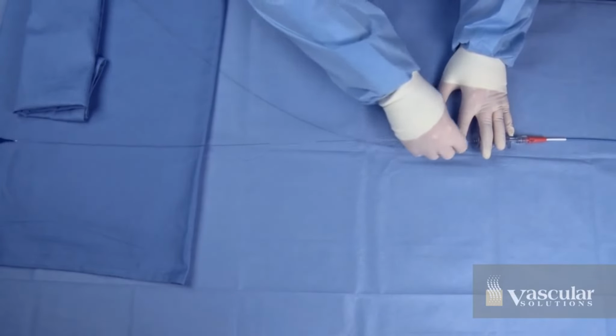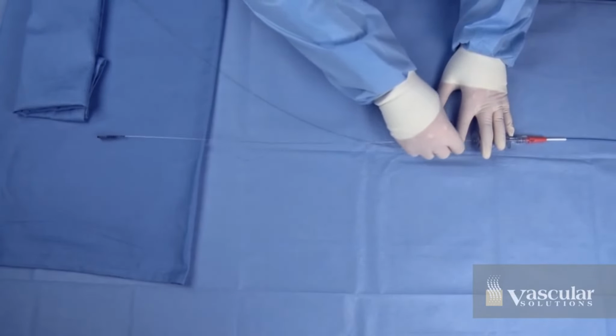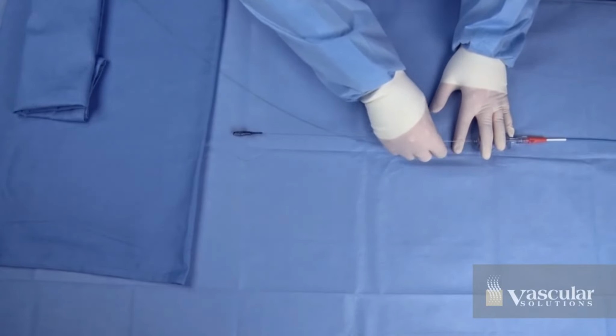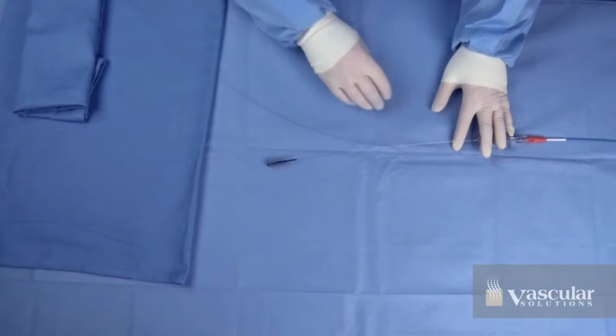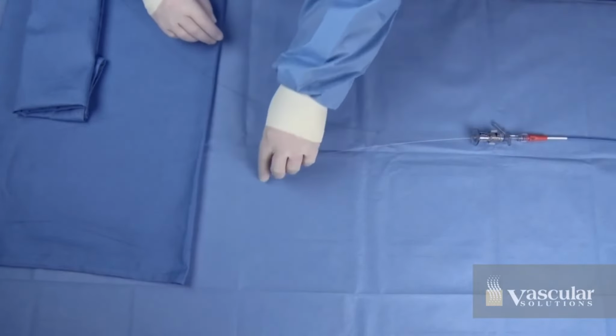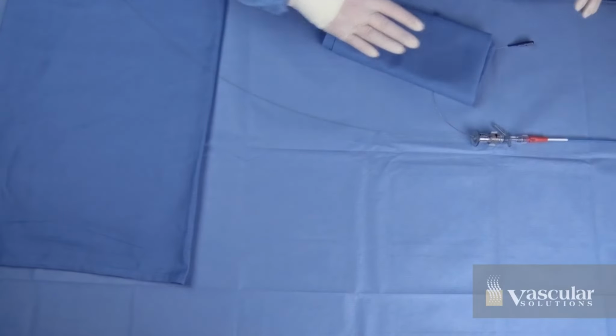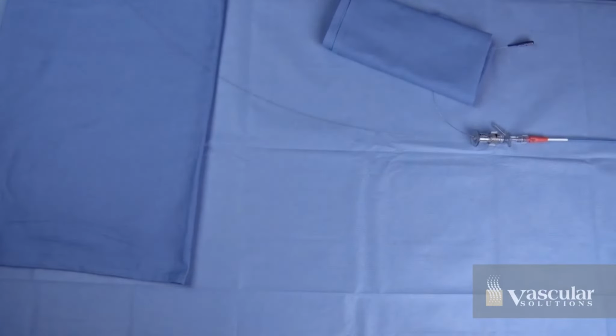To employ this technique, backload the GuideLiner over an in-place 0.014 inch guide wire and advance the catheter to its distal target. Once the GuideLiner has reached its distal target, move the push rod to the side and secure under a towel. By moving and securing the push rod away from the hemostasis valve, the potential for wire wrap in the GuideLiner half pipe and distal sections is minimized.